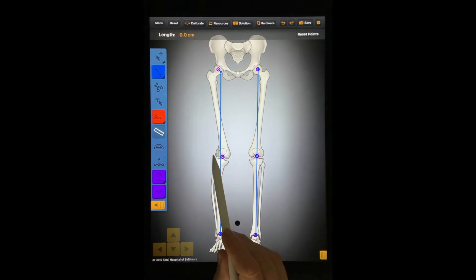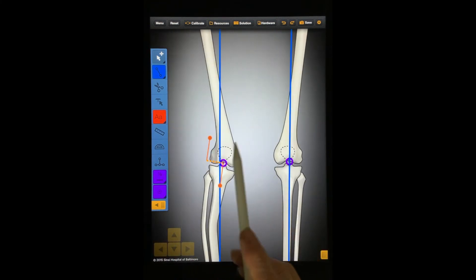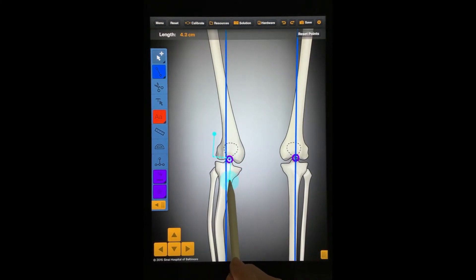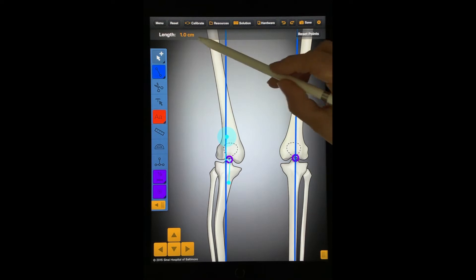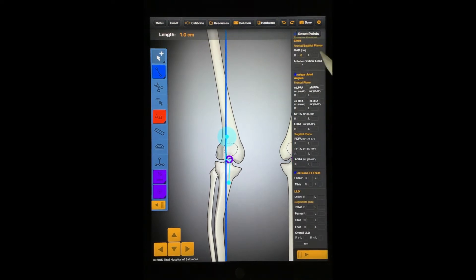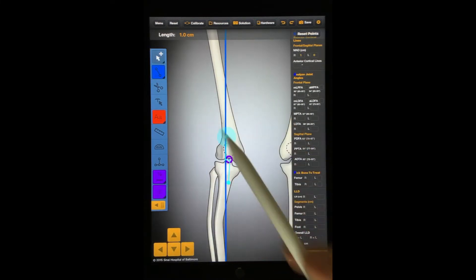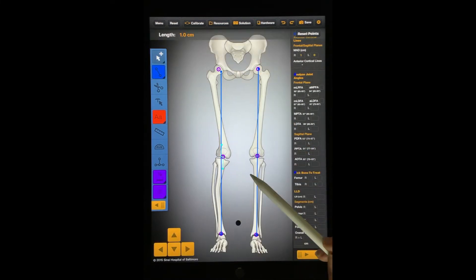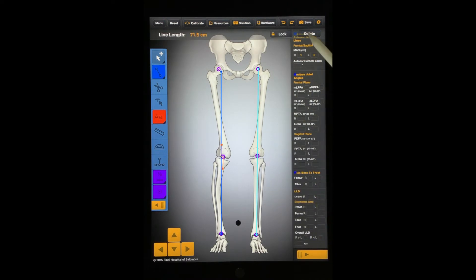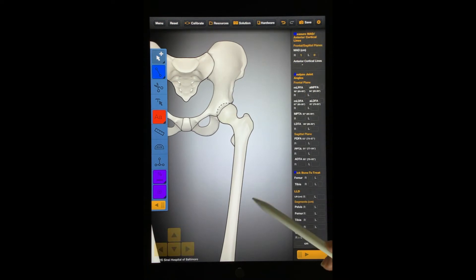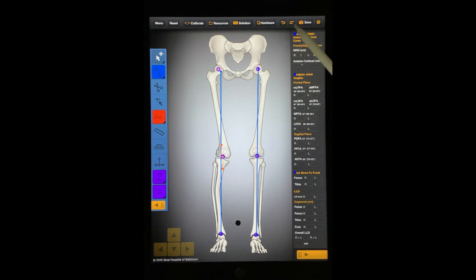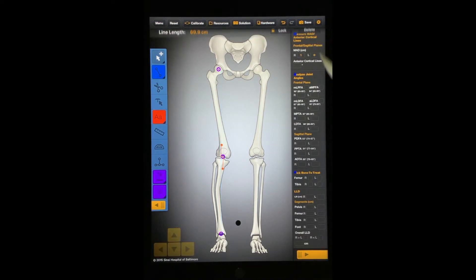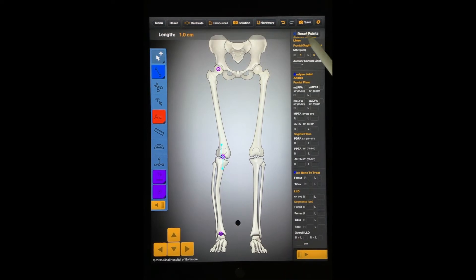The Ruler tool measures between two points. Let's use the Ruler tool to measure the MAD. Just a reminder — calibrate your image first. If you like, you can enter the measurement in the standard measurement grid. If you go back to the Selection tool, you can select and delete lines and dots. You can use the Undo tool, which will take you back a step, or the Redo tool, which will take you forward a step. To delete the Ruler tool, you must select Reset Points.